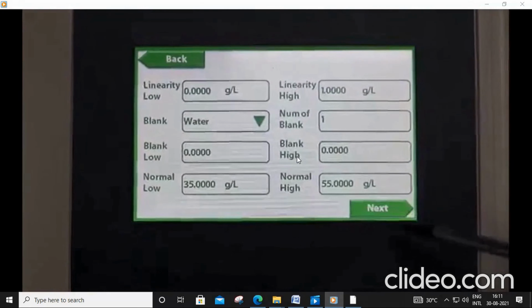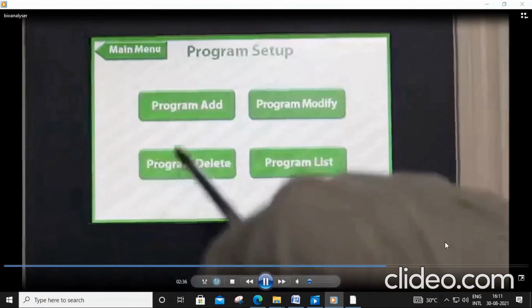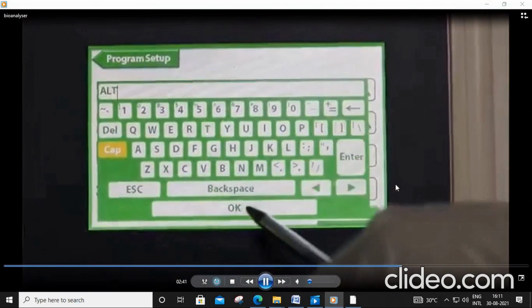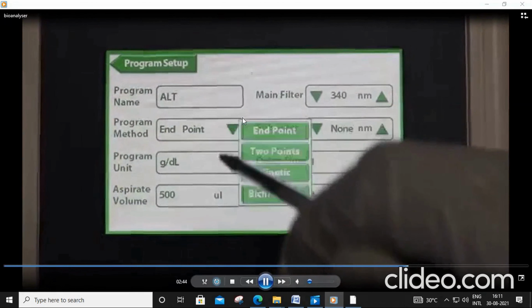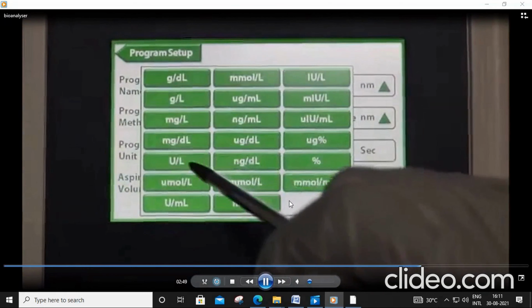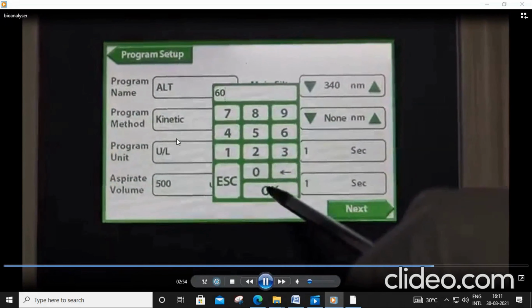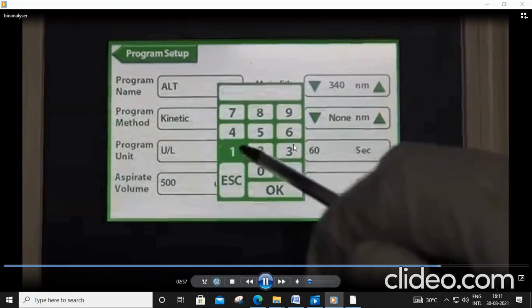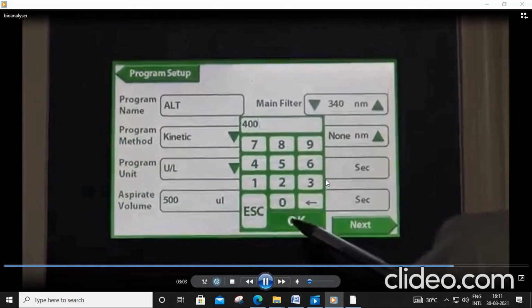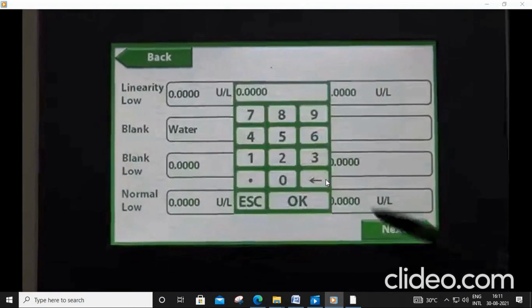Once that program is set, whenever we choose that program and run that program, and afterward whenever we are doing the biochemical test, we need to choose the name of the test. Then we can set the seconds, the kinetics, whether it is first order kinetics, zero order kinetics, etc. Then we can set the time for every event where to take the absorbance.